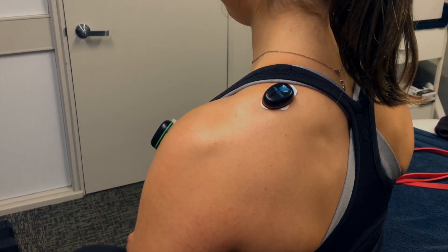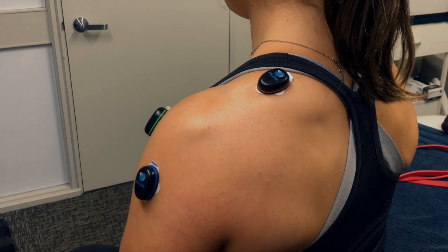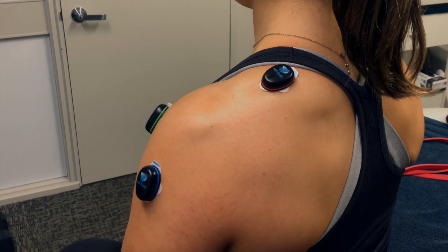Place sensors on the front deltoid, lateral and rear deltoids, and upper trapezius muscle.